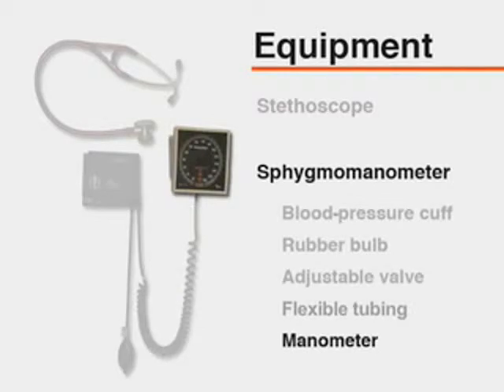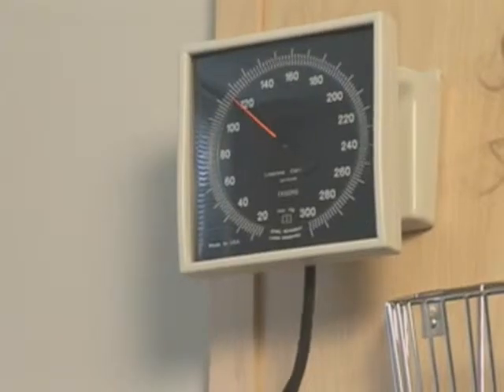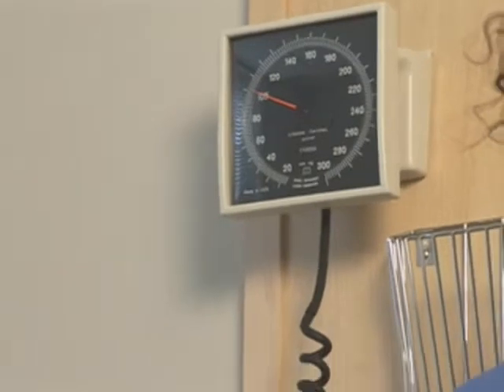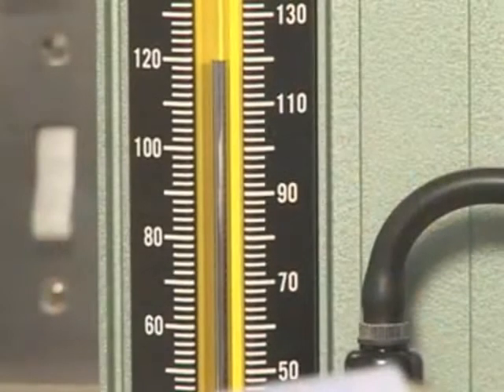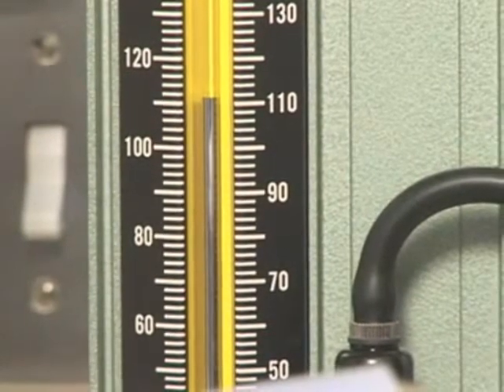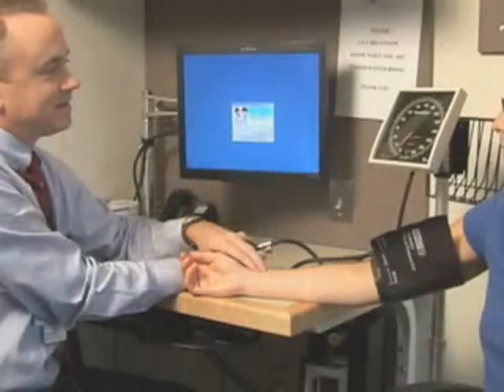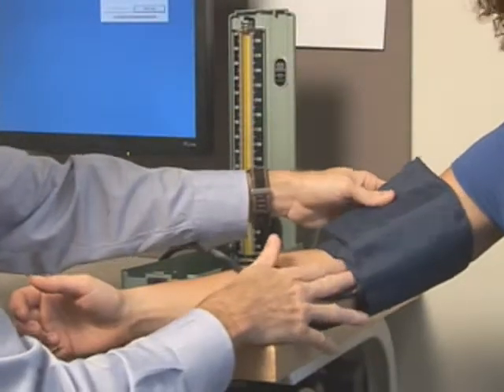Each part of the sphygmomanometer should be examined on a regular basis. The needle on an aneroid manometer should rest at 0 before and after measuring blood pressure. Aneroid manometers should have scheduled recalibration at least every 6 months. Concerns over the toxicity and environmental impact of mercury have led many institutions to use aneroid manometers exclusively. The steps required for accurate indirect measurement of blood pressure are identical whether using an aneroid or mercury manometer.